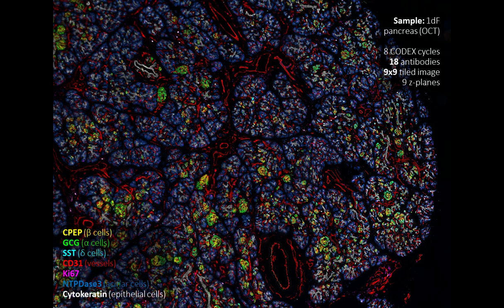And you can see in the bottom left-hand corner, I'm showing you different cell types that are highlighted in this particular panel. So although we used 18 antibodies, only 7 are shown in this particular image, just for purposes of color and visualizing. And so you can see very quickly that the compartments of the pancreas that I showed you in those initial images in the introduction are very easily visualized by these CODEX antibodies, particularly the blood vessels shown in red, as well as the endocrine cells or islet clusters that are shown in that yellow, green, and blue color.